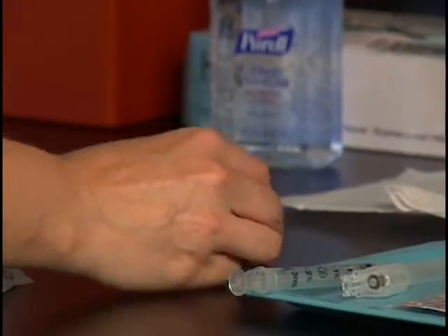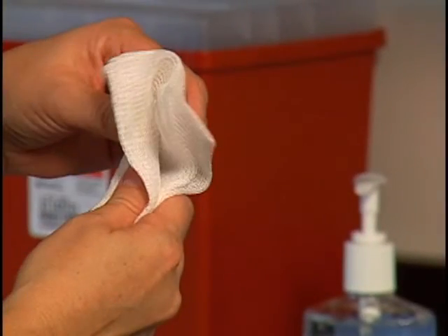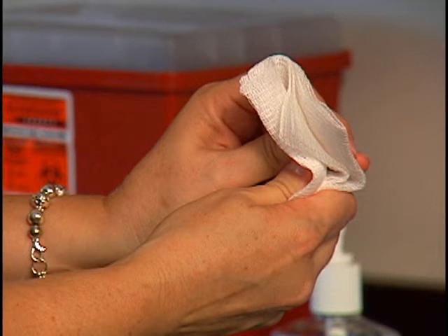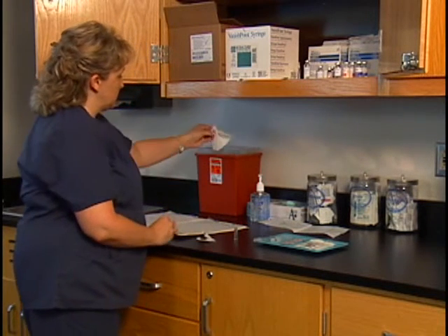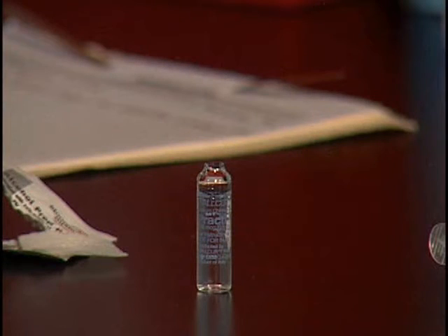Place a piece of gauze around the neck of the ampule. Hold the base of the ampule between the first 2 fingers and thumb of one hand. Hold the neck of the ampule between 2 fingers and the thumb of the other hand. Apply a strong, steady pressure with the thumbs and break off the stem by snapping it quickly and firmly away from the body. Discard the stem and gauze in a biohazard sharps container. You are now ready to withdraw the medication from the ampule.